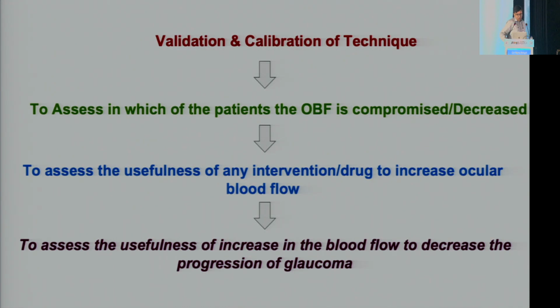Okay. So I end my slides with this: whatever we do, OCT angiography, ocular Doppler, we should go ahead with validation and calibration of our technique.